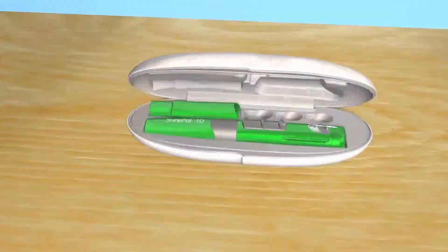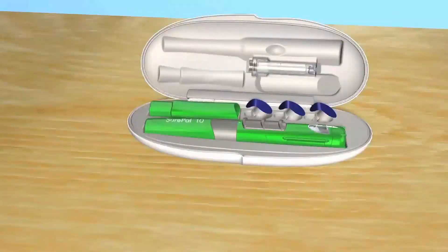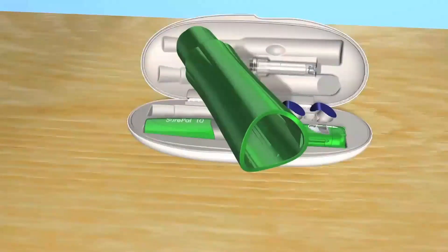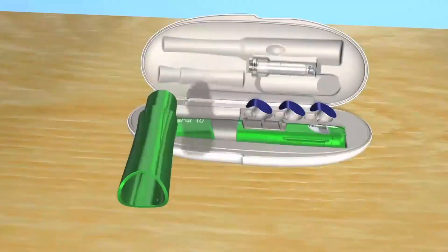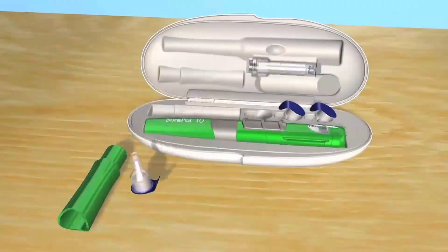We're going to show you all the parts of your SurePal. Take your own SurePal apart as you follow along. You'll have to get your own needles and Omnitrope preassembled cartridges. When you have them, you can store them in this SurePal hard case. This is an optional needle hider — you can use this if you don't want to see the needle. Take it out and put it on the table. Take a needle and put it on the table next to the needle hider.